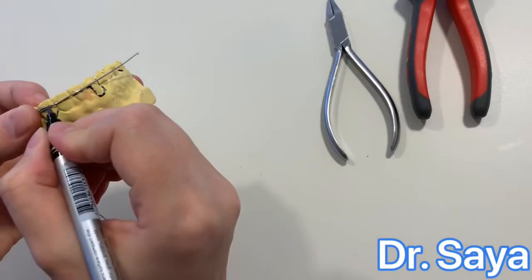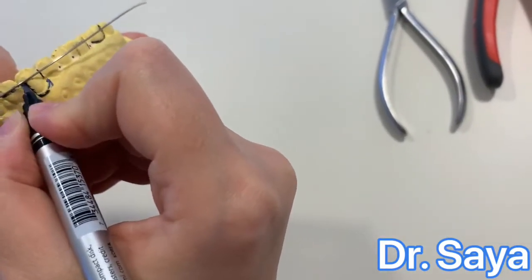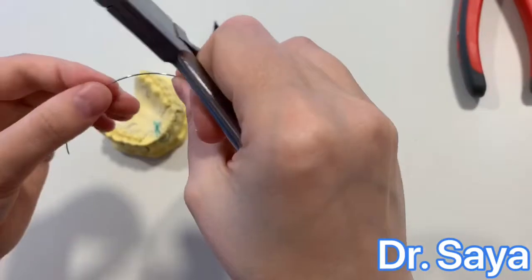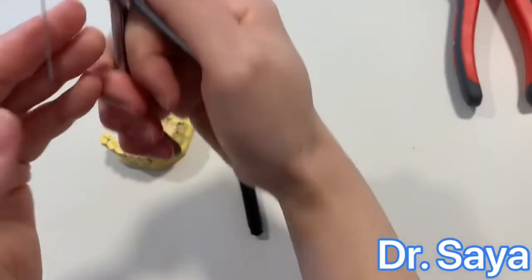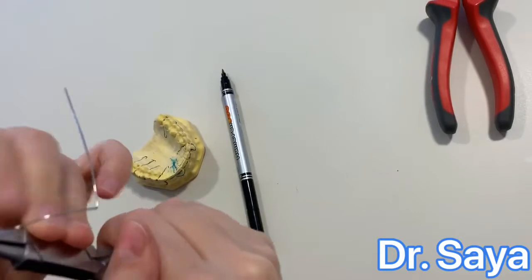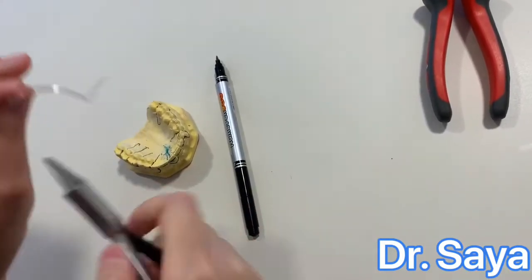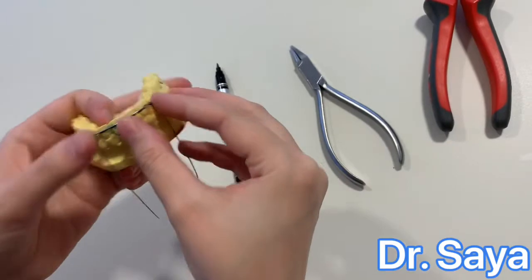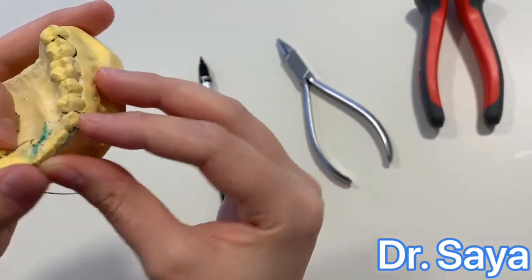Mark the canine position, making sure that the incisal segment is seated at the incisal third of the anterior teeth. At the buccal groove of canine, mark again with the plier's straight side. Hold the plier before the mark we made, with the wire and the plier at the same plane, and make a 90-degree bend. From buccal groove of canine to buccal groove of canine, the wire will be adapted.